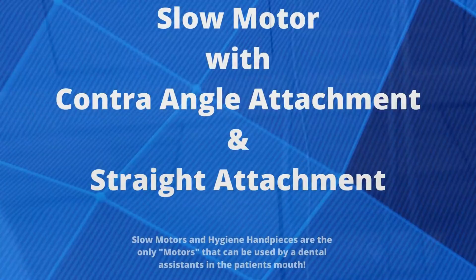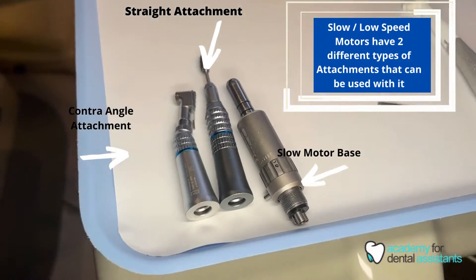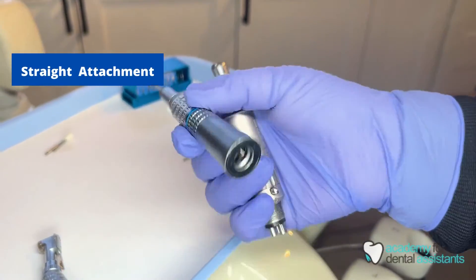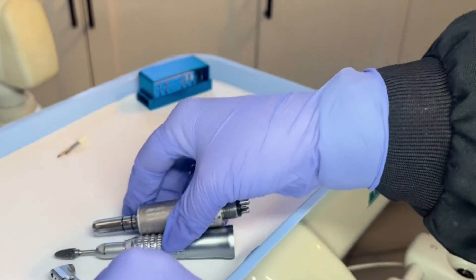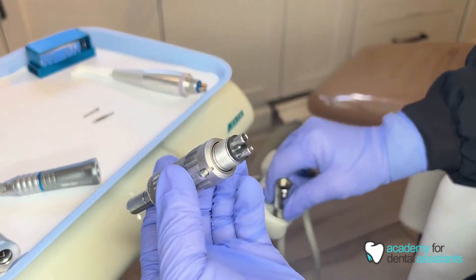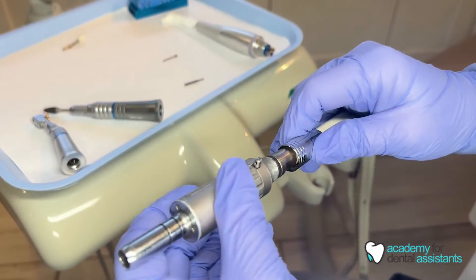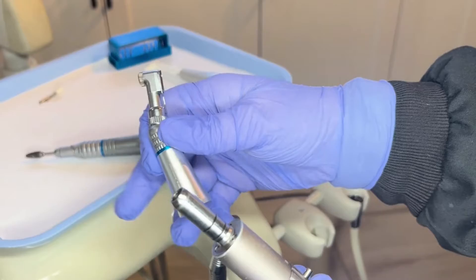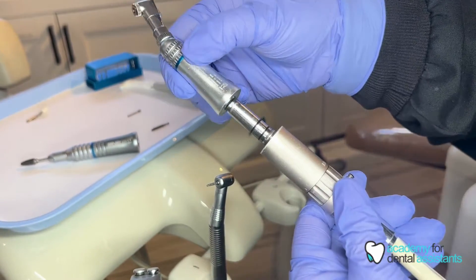This is the motor itself, this is the straight attachment, and this is the contra angle attachment. They have openings in the bottom that snap onto each piece. You first want to connect the slow motor to the dental unit by lining up the holes and twisting and locking it in place. You then take the attachment — this is the contra angle attachment — and snap it in place.